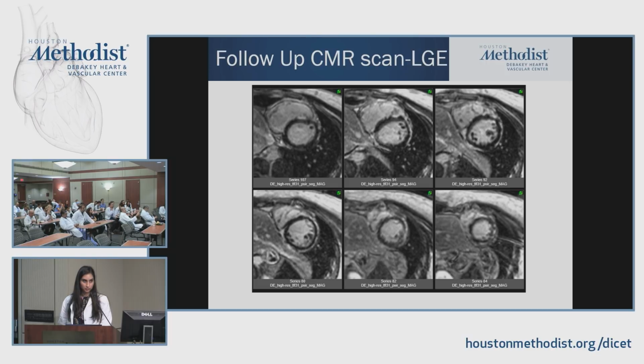Okay, so does that mean there's active myocarditis still ongoing? No, this probably means there's been necrosis of the myocardium in the site where there was active myocarditis at some point. Wherever there's myocyte necrosis, myocytes don't regenerate, so that area will still hyperenhance on follow-up imaging. But as the edema resolves, the size of the hyperenhanced zone will get smaller. If you had very small areas, they could get smaller to the point where they're below the resolution of your technique, so you may think it's gone, but that's not the case. So I don't think you should infer from this that there is ongoing myocarditis. I think this is just indicative of the normal convalescence. Yes.